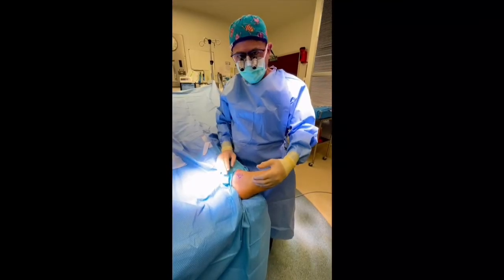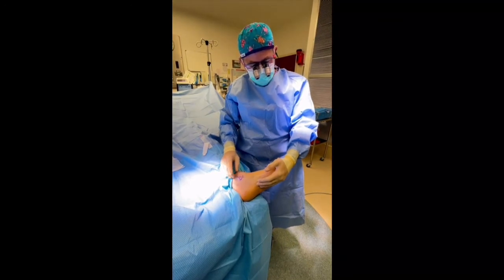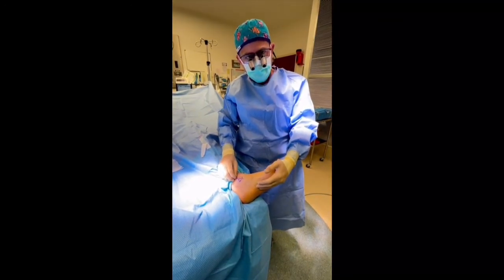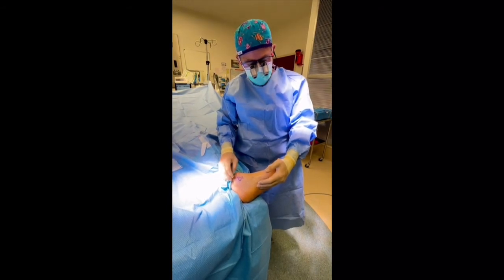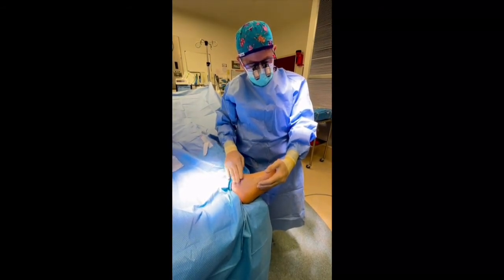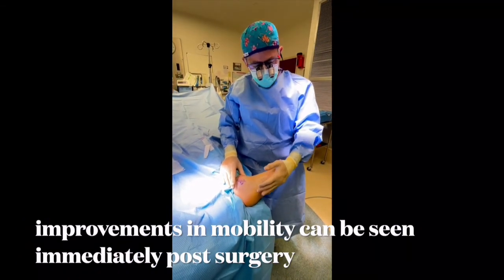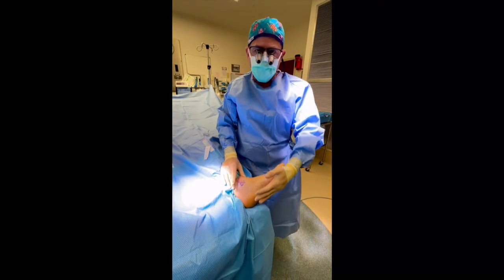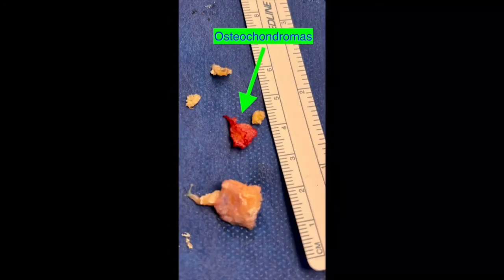Alright, so we're done with the surgery. As you can see, with this particular surgery we use a stitch called monocryl, which gives a very small scar if any. This will be in here for about three weeks and starts to dissolve. He's able to move his ankle much better now, and most importantly the bump's gone, and hopefully the osteochondroma won't return — they usually don't.